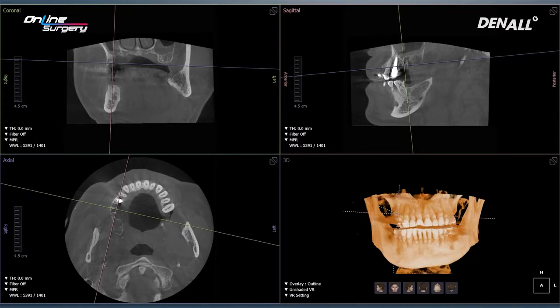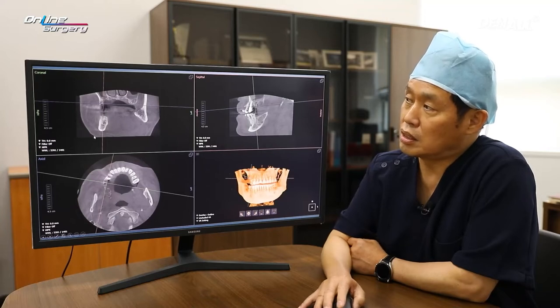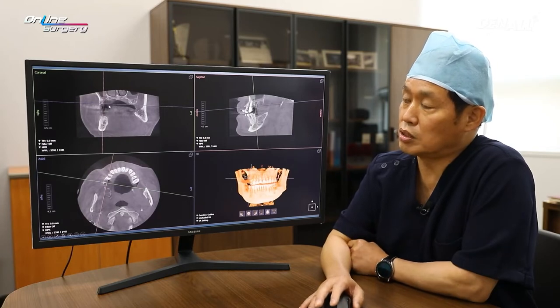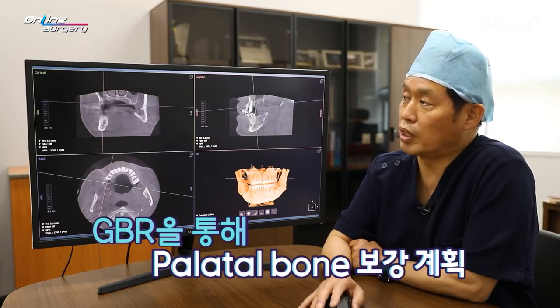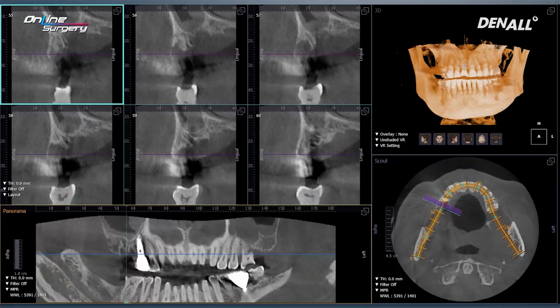Let's look at the CT on number 16. On the buccal side, there is a lot of residual bone. I think when extraction was done in the past on the palatal root, there might have been a very severe lesion. Palatal bone has been lost a lot on CT. The residual bone height is quite favorable on the buccal side, but on the palatal side there is a lot of bone loss.